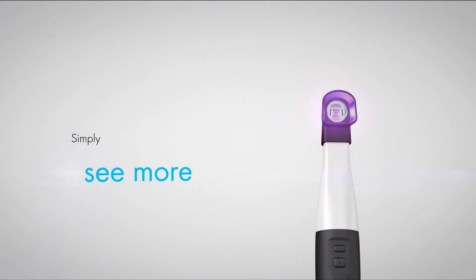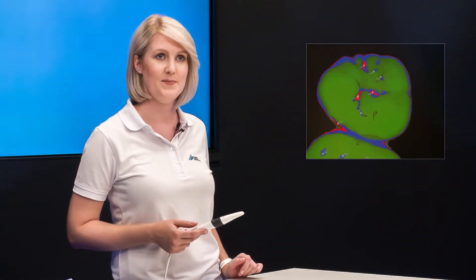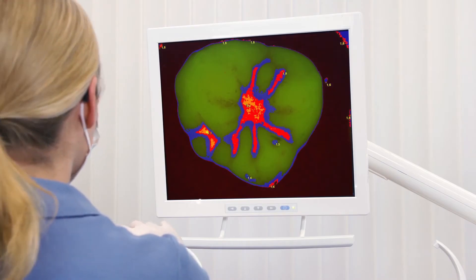The operating principle is quite simple. The camera emits a blue-violet light that activates the metabolic products of cariogenic bacteria and makes them shine with red fluorescence. Active caries therefore appear red, while healthy enamel lights up green.